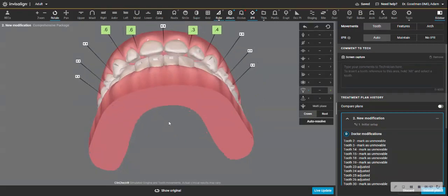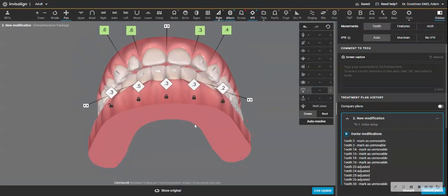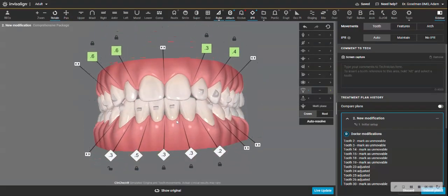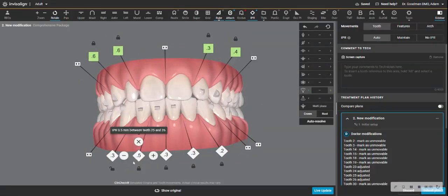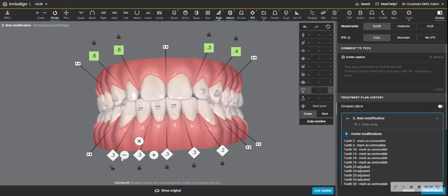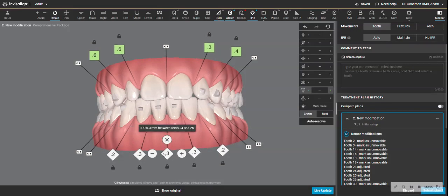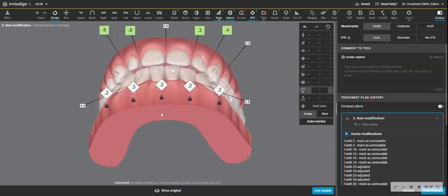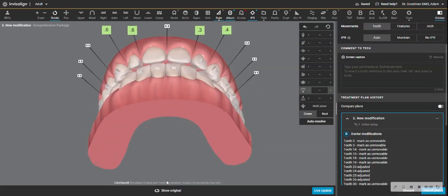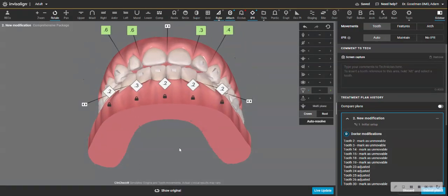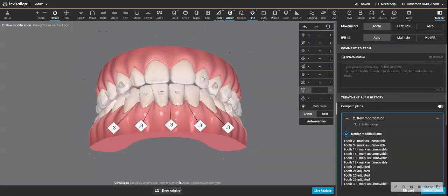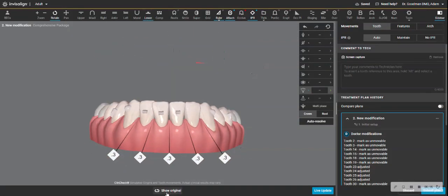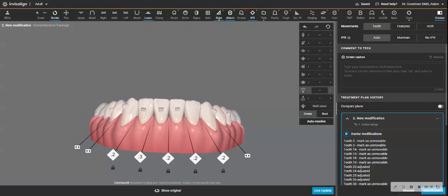Notice that little change I made actually led to more overjet. So I'm going to just lessen the amount of the IPR now because I don't need to have overjet where I'm starting edge to edge. Let's see. The dark triangles are inevitable. All right. And then the rest of the ClinCheck looks okay.